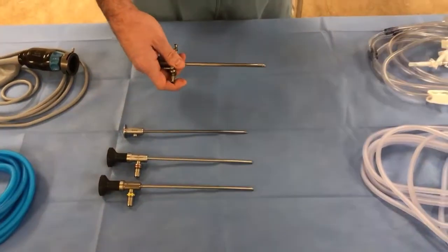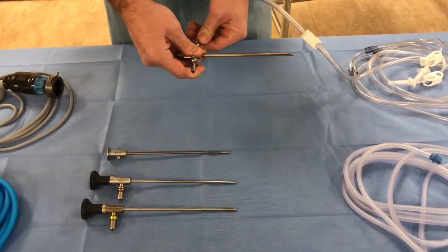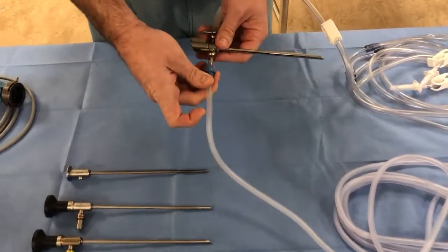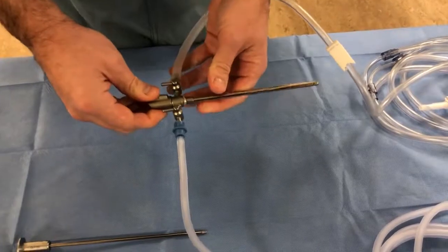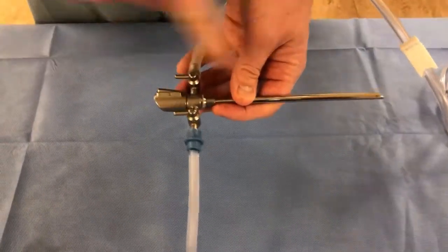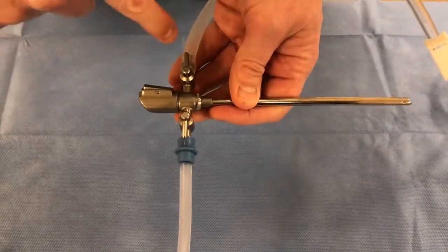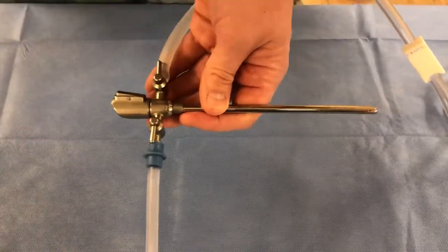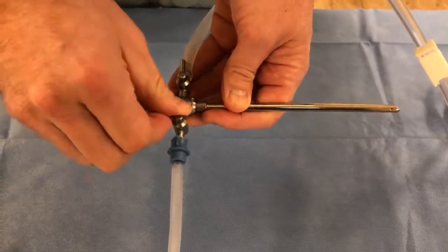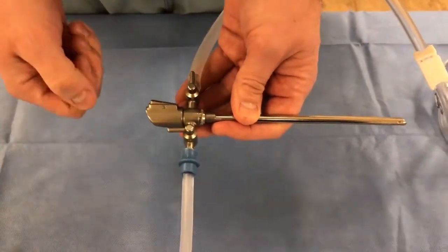First, we'll take the sheath and attach some inflow and outflow to it. This is our inflow tubing. The outflow tubing we generally cut to allow it to fix there a bit more securely. Notice that the inflow and outflow in this setup are directly opposite each other — if you have both valves open, fluid will just flow directly into the outflow and nothing will enter the joint. In general, you keep the outflow off while the inflow is on, and turn the outflow on only when you need it.